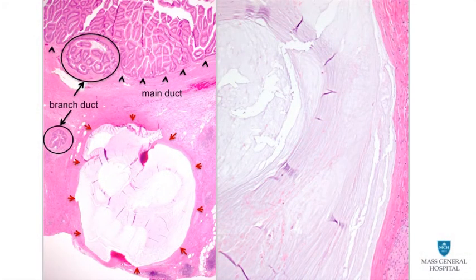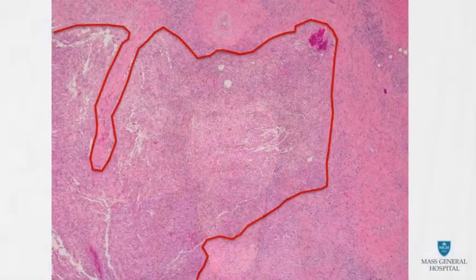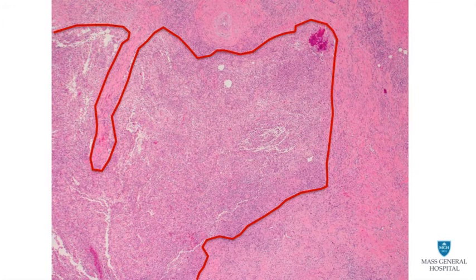In this patient, in addition to the main and branch duct involvement, there are scattered acellular mucin pools, marked by red arrows in the left-hand side slide. As shown on the right, the mucin pools are not lined by epithelial cells, consistent with mucin extravasation secondary to rupture of branch ducts, but not invasive carcinoma. In addition, there are a few large collections of inflammatory cells, indicative of resolving abscesses. The findings are consistent with the patient's history of repeated pancreatitis.